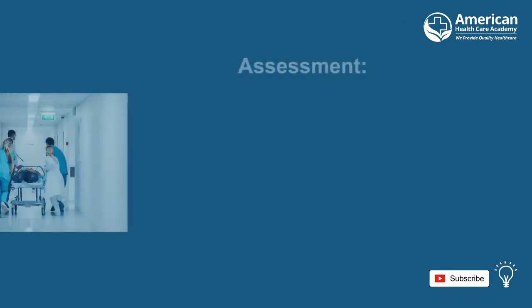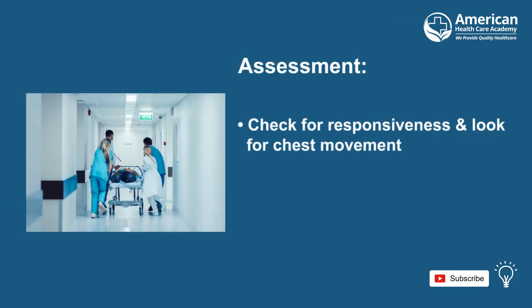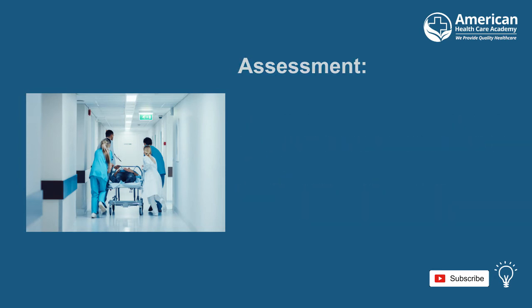You must first assess the situation. Check him for responsiveness. Tap him and shout, "Are you all right?" and look at his chest for any movement. Then when you check his carotid pulse, you determine no pulse is present. Call a code and get the code team in place.